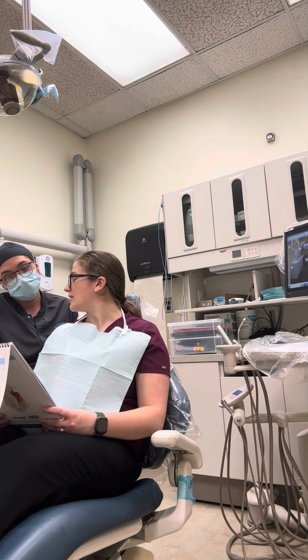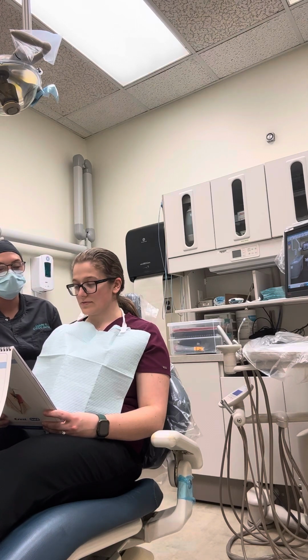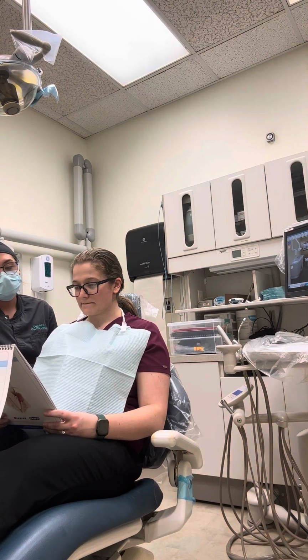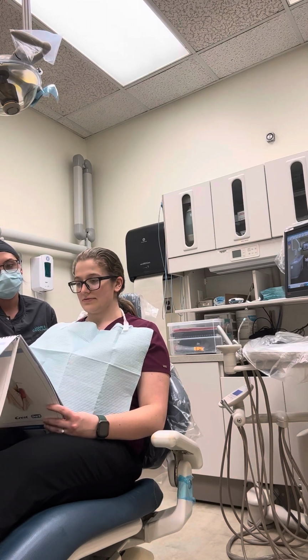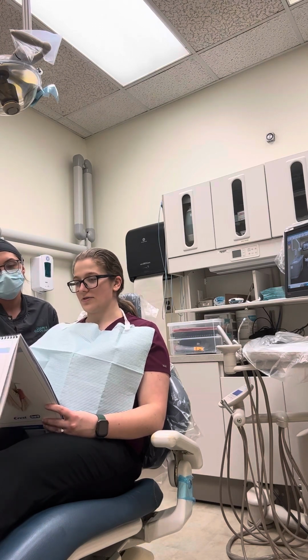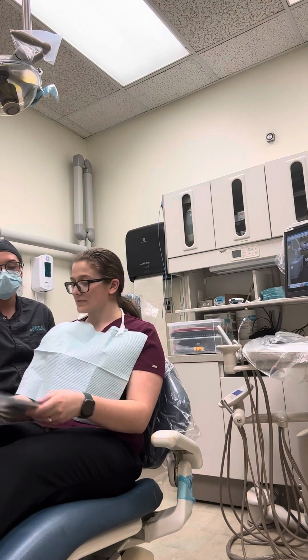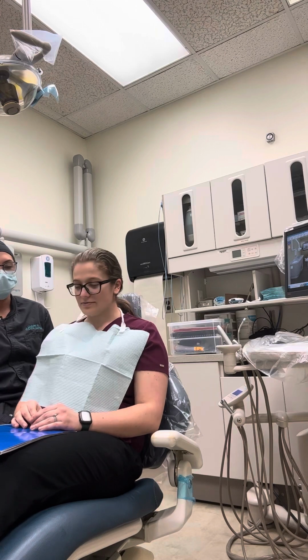Yeah, I really like using the floss picks because it's easy. You can just do it with one hand. It's a lot easier. And then a water pick you could get as well. I would definitely recommend it. Okay. Yep. And then those you shouldn't need because of the braces. Oh, okay. So this is the water flosser then. Yep. That one is obviously a lot easier. It doesn't take the place of flossing, but it does help. Okay.